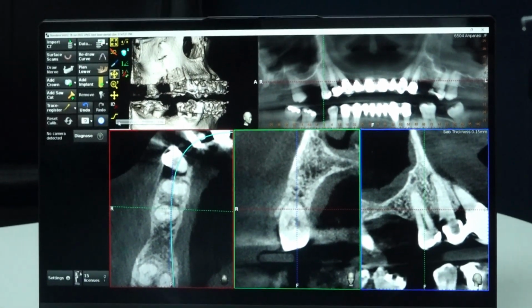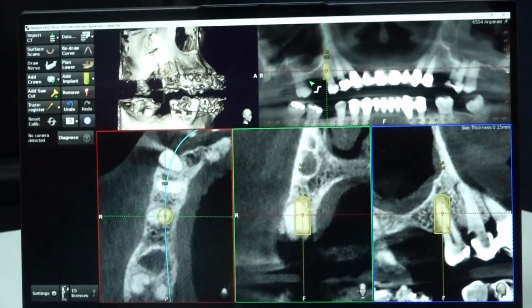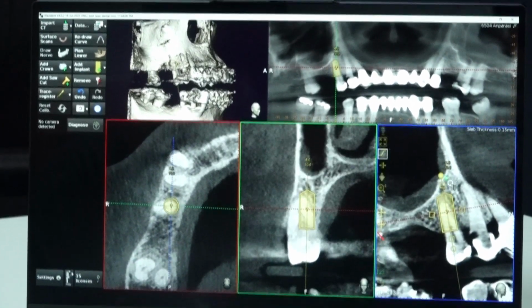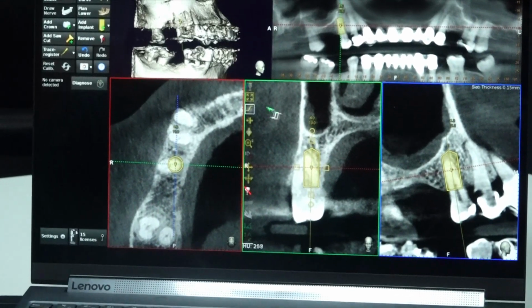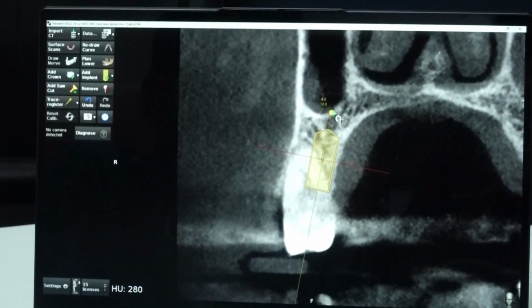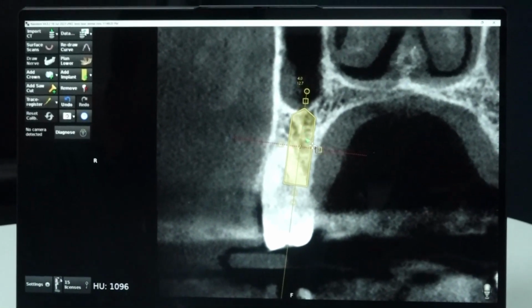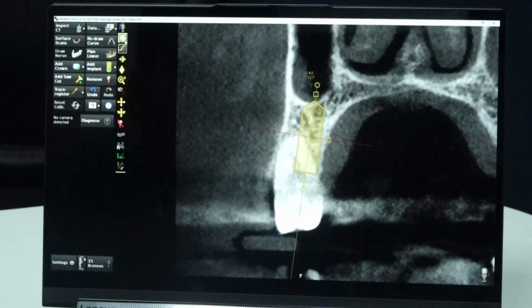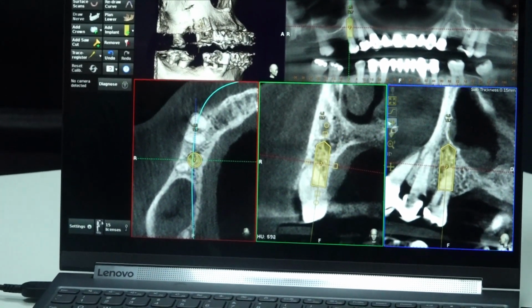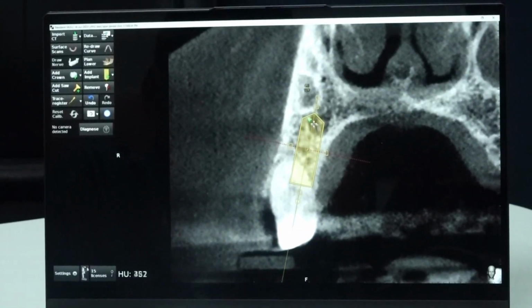Now, one implant in the second premolar. Exactly axial placement along the socket. If you see here, the sinus is expanded very near to the apex, as we have seen from the panoramic view. About 12 mm implant. We will try tilting the implant mesially. The moment you tilt just 5 degrees, you are getting good bone. But still there is sinus here, no?